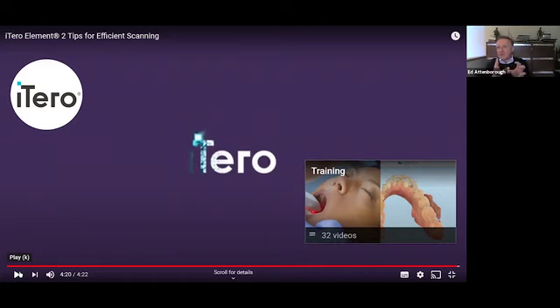Now that's great, because it's self-correcting in the same way as it can automatically fill holes. But let's remember that's not recorded data, that's interpolated data from the software surmising what the arch should be. So there is inherent measurement error introduced not only in the hardware of the recording device, but also in the software which is interpolating the data.